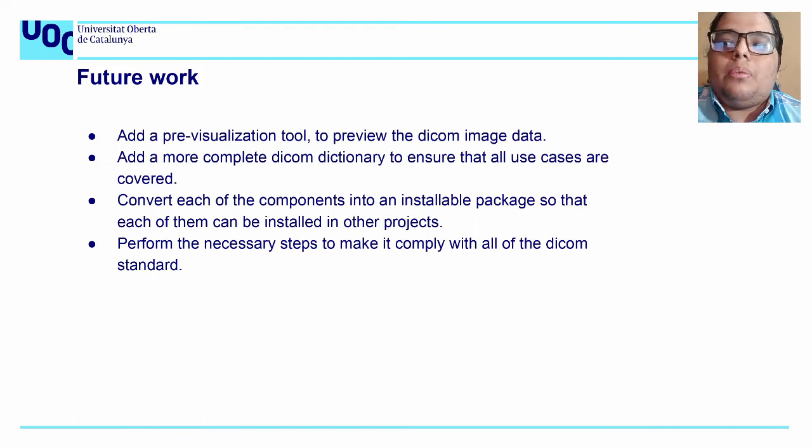Future work. To improve this work, we can add a pre-visualization tool, add a more complete DICOM dictionary to ensure that all use cases are covered, convert each of the components into an installable package, and also perform the necessary steps to make it completely comply with the DICOM standard.